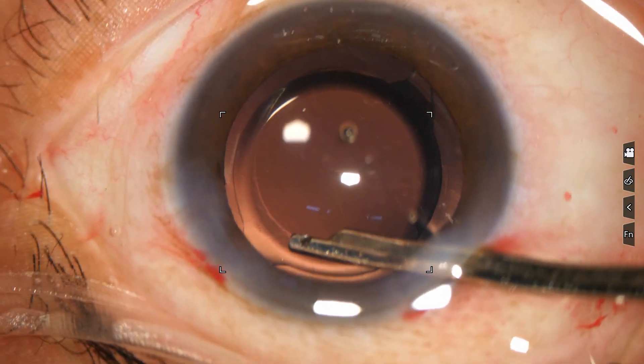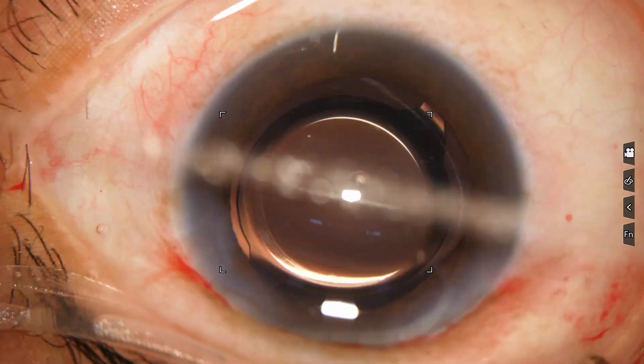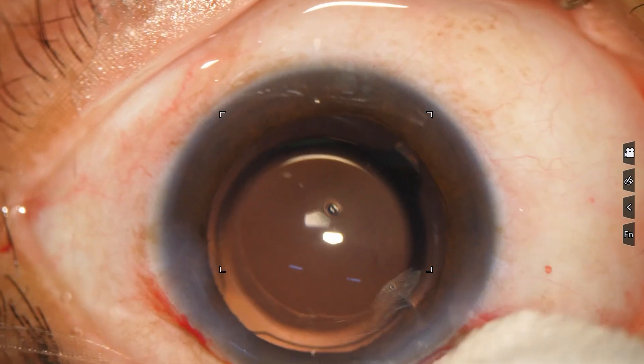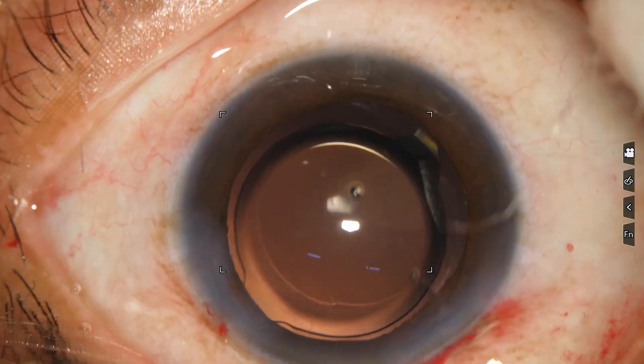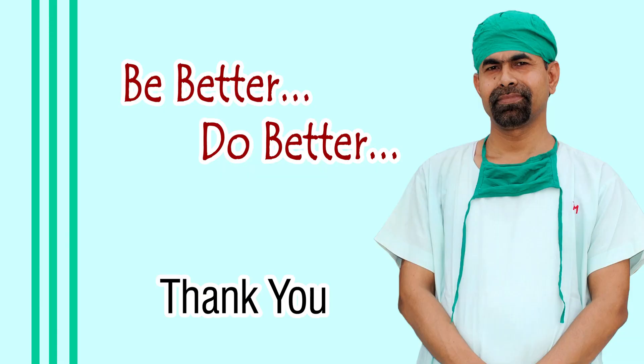You can see that the optic of the intraocular lens is nicely covered by the anterior capsular rim. Integrity of all the wounds are checked. A few drops of Moxifloxacin are applied over the ocular surface and the case is concluded. Hope this video will help you in developing your surgical skills. Be a great surgeon and serve your patients with love, respect, empathy, and great surgical competence.